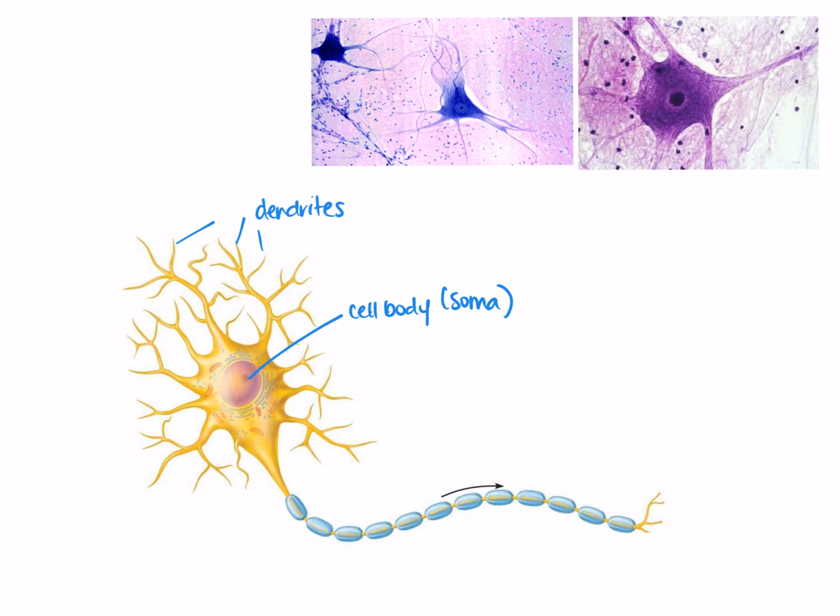From there, unlike normal cells, the neuron cytoplasm just extends out to form the axon. All the way, yep. And all the way here, yep. Now, with some axons, specifically what happens is we get myelin wrapping around certain regions of the axon. In this case, we're looking at a myelinated axon, and the myelin is reflected by these bluish coats that we can see around the axon itself. So that's why it's a myelinated axon.